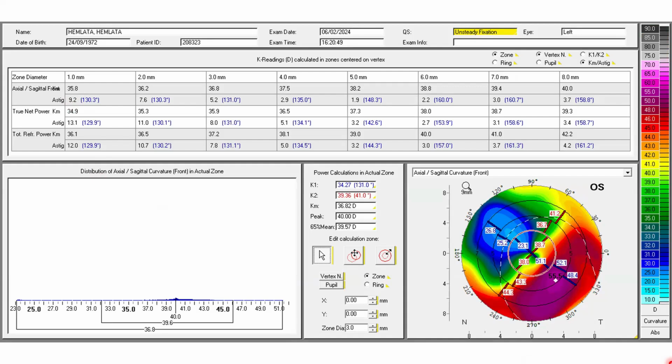In fact, it was a very challenging case because in the area of the patch graft, the visibility behind the cornea was very poor, and obviously, the patient was wanting to do a femto-assisted surgery. So the rhexis was completed in the RK portions, and where there was also a need to complete the rhexis, in the area behind the opacity, I had to just fashion a rhexis with very little visualization. But I'm hoping that it will come out somewhat better.